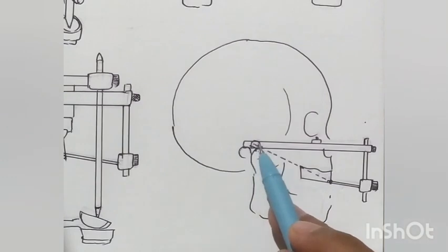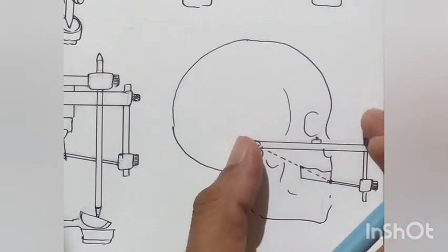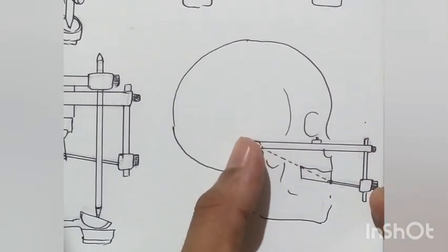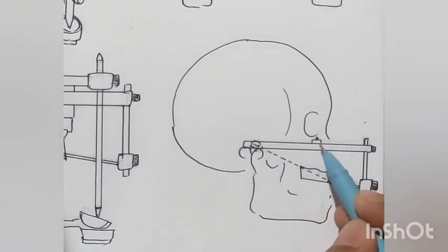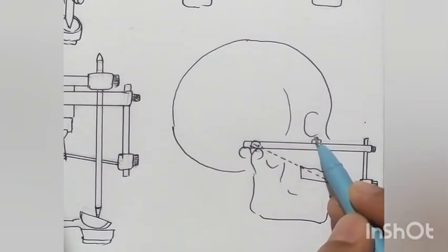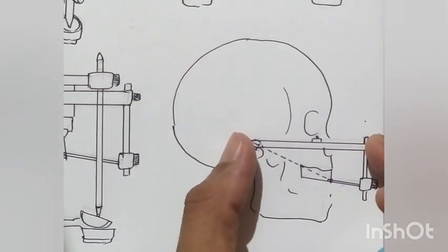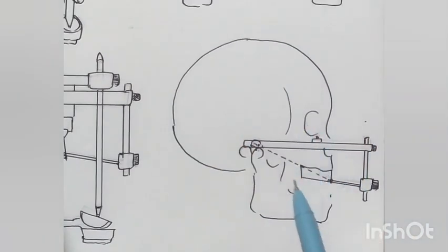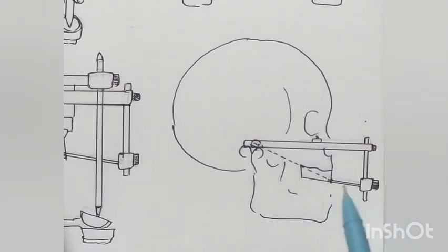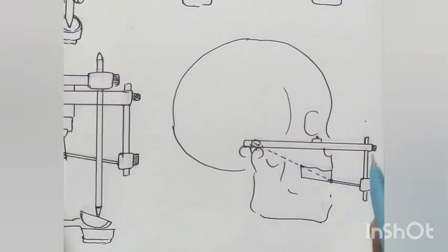With the help of the face bow, we have a posterior reference point where we fix our condylar rods to the condyle. The face bow can be in any rotatory position, so to fix this rotatory movement we use an anterior reference point — the infra-orbital notch. When we fix this posterior point and this anterior point, our face bow is fixed in position, and now we can record the position of our occlusal plane and maxilla with the help of the wax fork connected to the U-shaped frame.